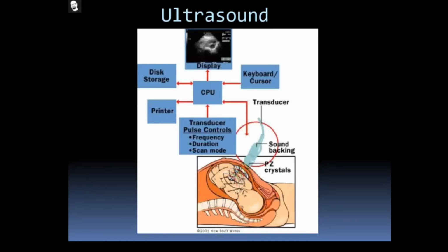So the doctor can identify exactly what the condition of the patient is through the video. At the same time, if you are doing any project for your final year, or a research project, and you take any ultrasound image, it can't give better resolution than CT and MRI. Why? Because the ultrasound machine, if you use it for scanning, is purposely used for real-time monitoring. For real-time monitoring, this ultrasound is the best. But if you take an ultrasound image for a project, it does not give any kind of resolution for processing the image. That is what you need to note.